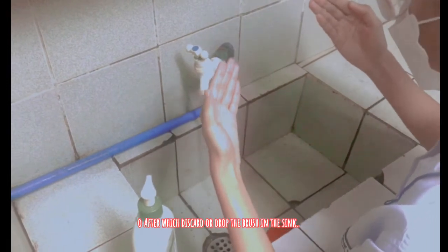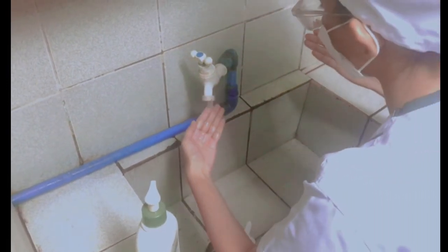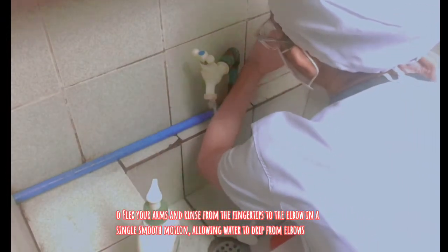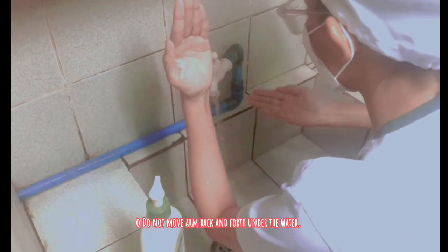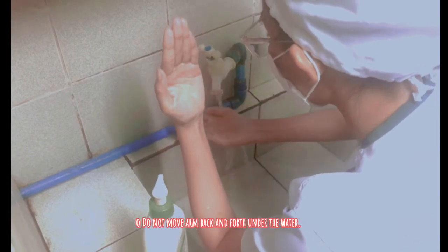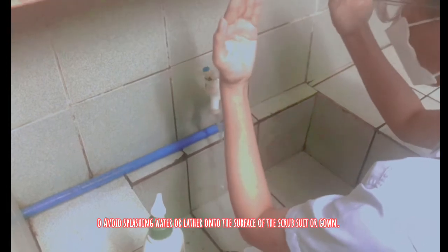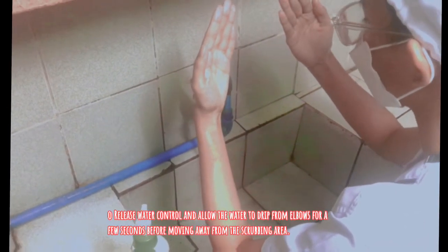Discarding the contaminated brush prevents microorganisms from soiling the hands. This process avoids soiling or contaminating the hands after scrubbing. It also allows the flow of the water from least contaminated to the most contaminated area. Dripping hands on the floor may spread or harbor microorganisms.